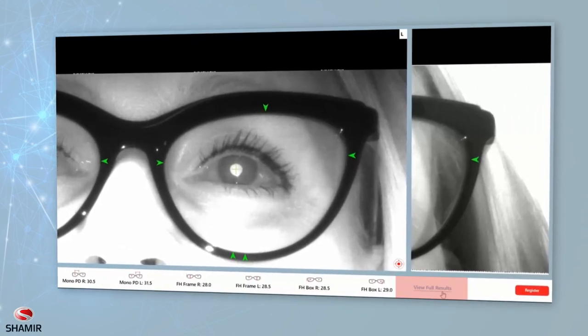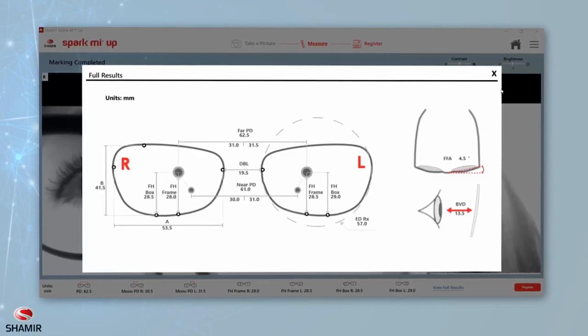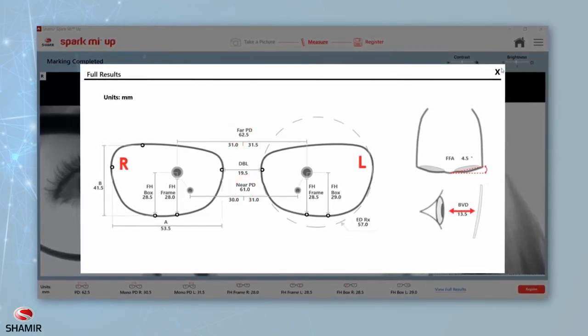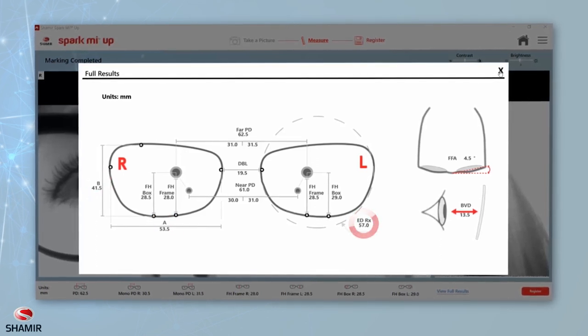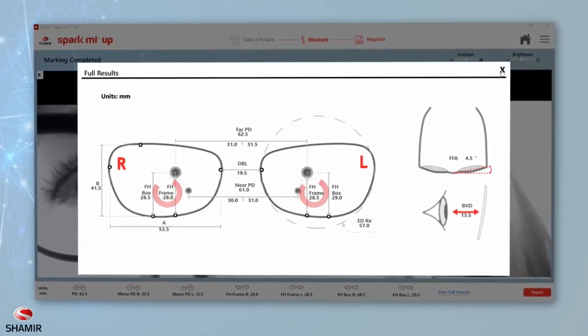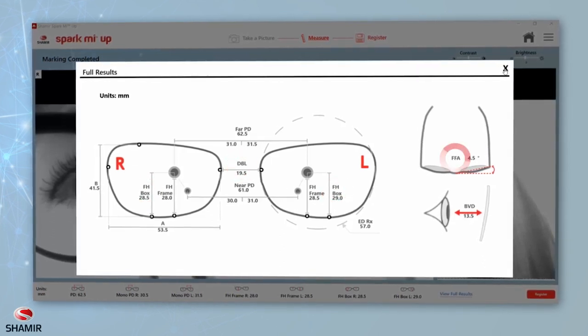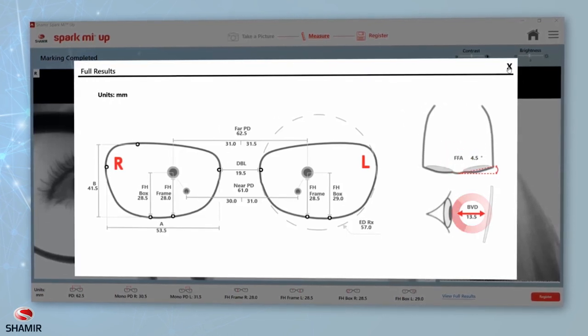You can view the full results at any time by clicking on Full View Results. The results will include the following patient measurements: far and near PD, mono PD, A, B, and ED measurements, fitting height from frame and fitting height from box, DBL, panoramic angle (also known as face form angle), and back vertex distance.